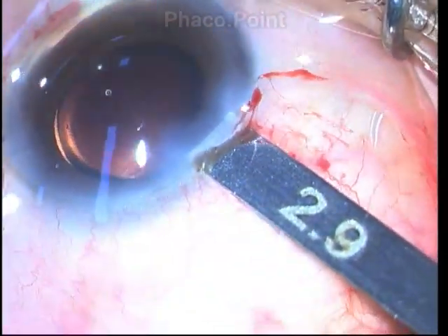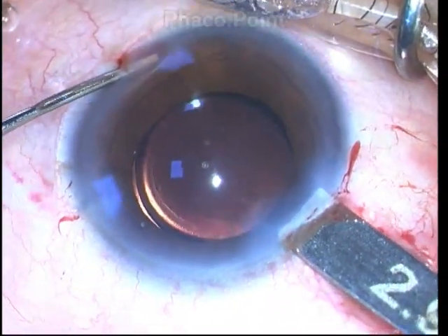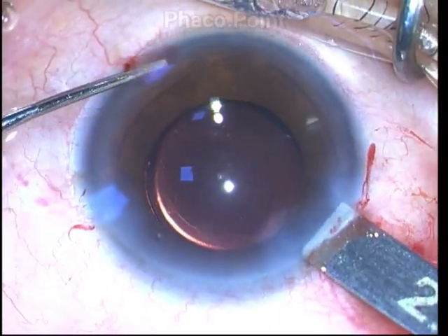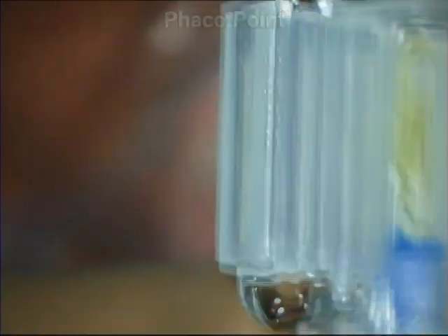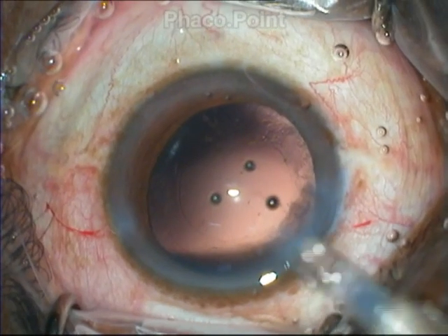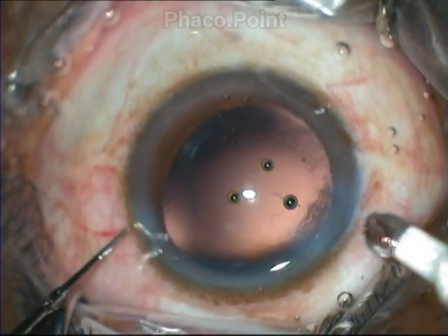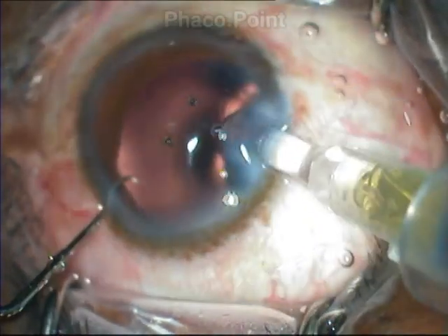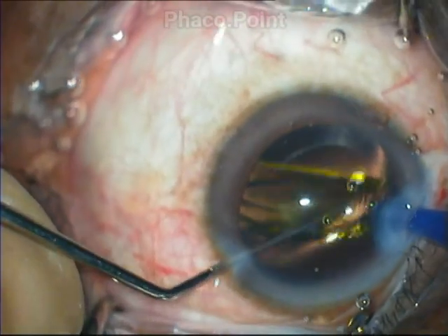We still find it difficult to pass the 2.9 mm caliper into the eye. In this case I performed a wound-assisted injection of the intraocular lens. A similar nozzle model is seen in the CT Lucia lens — I have no financial disclosures to make with respect to this — which also has an outer diameter of 1.65 mm and a 4.5 mm cylindrical zone of the same diameter, so the nozzle can be placed directly within the anterior chamber and the IOL injected directly within the capsular bag.